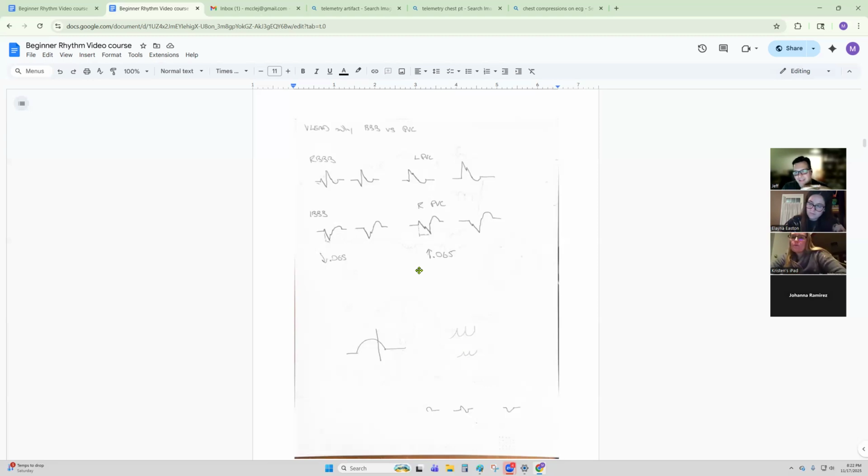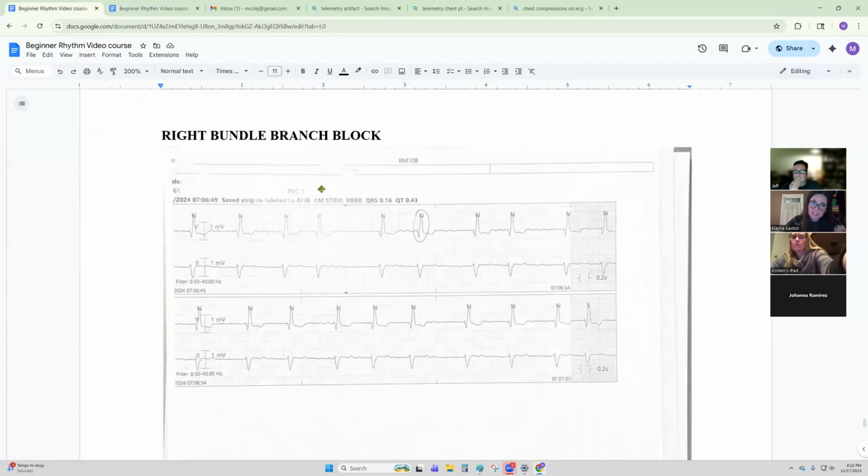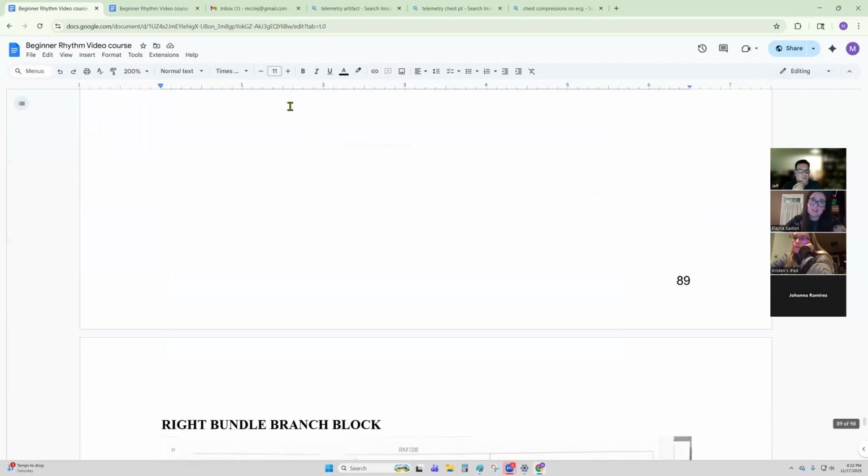Lena, what'd you think of that? There's a lot right there. It is. I can definitely see the differences, and that makes sense with the nadir, but I also plan to look back and see exactly what it's the measuring of the dip. I guess, could you repeat what the nadir is again? Sure.